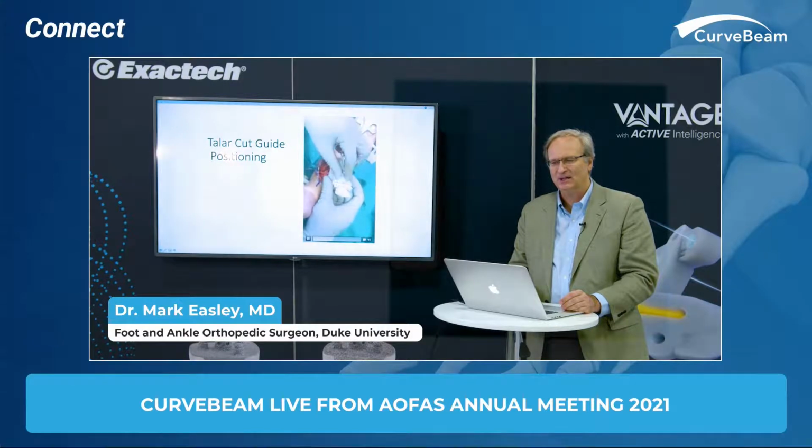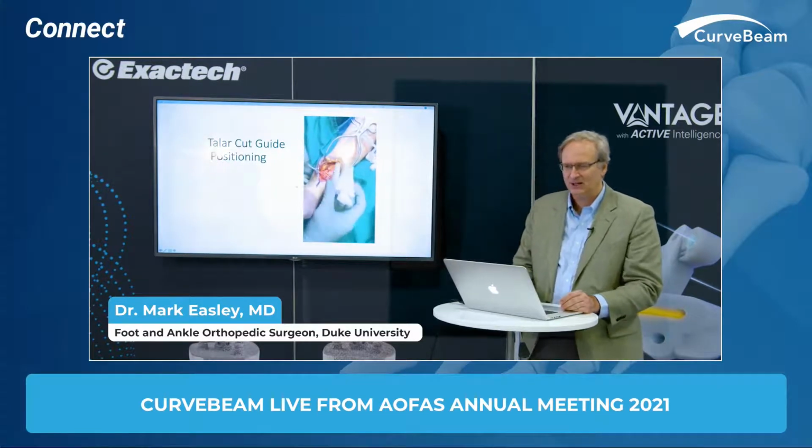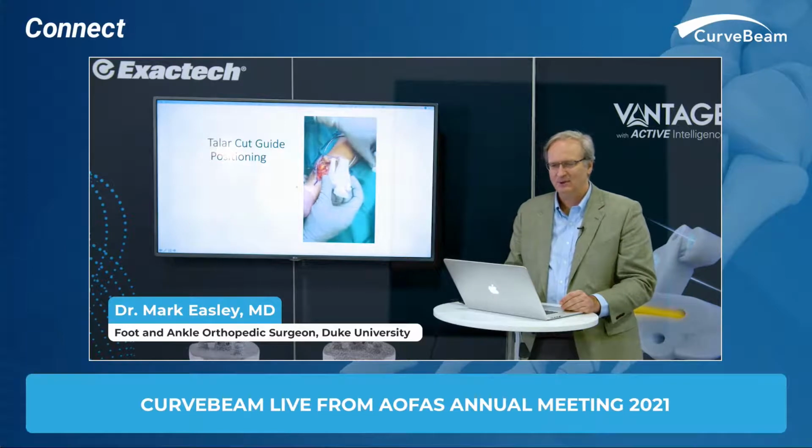So the talar cut block is going to sit there, but it's still going to cut through the tibia again in this coupled configuration. You can see there, I've made the tibial cut, but my talar cut is actually going to cut through the tibial osteophyte one more time. So we're not going to remove those osteophytes at all. We're going to leave those because we really use all the bone there as landmarks, and then the osteophytes stay in place so I don't disrupt any of the anatomy there that I use for my preoperative planning.